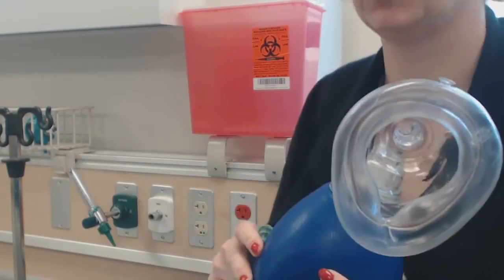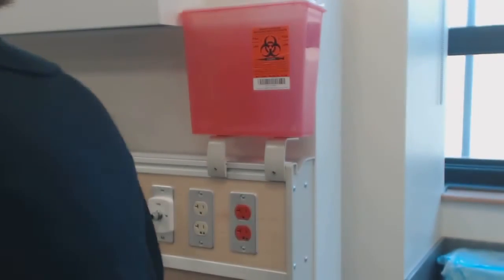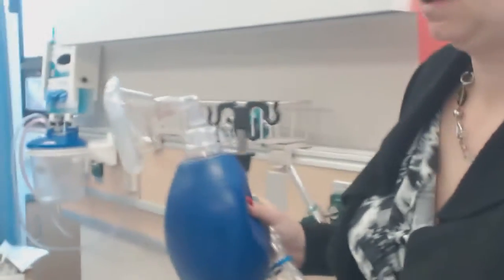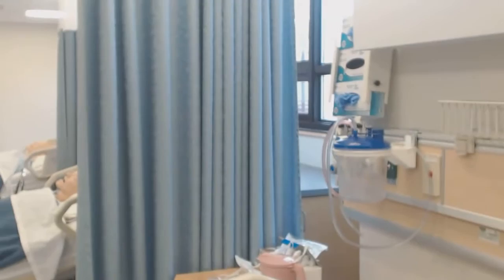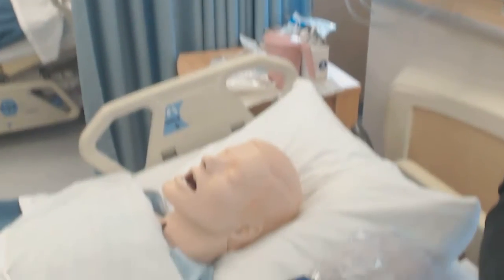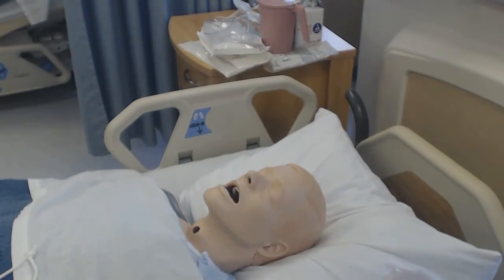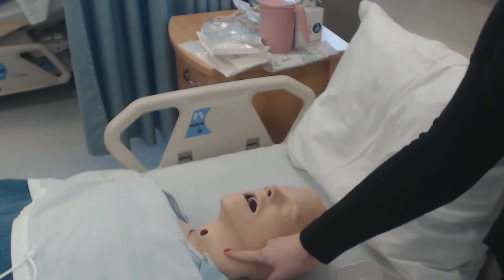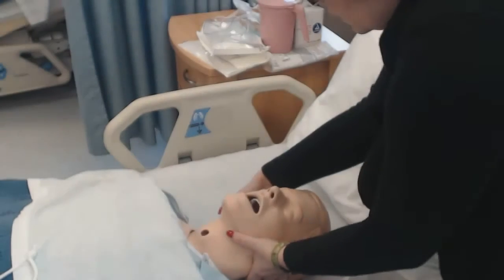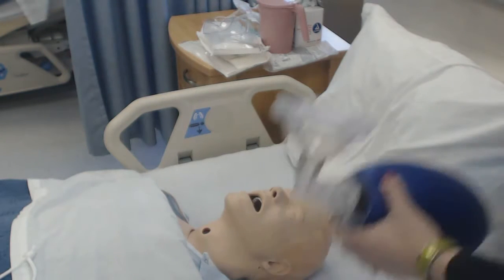Give a little positive pressure. When we put the Ambu bag on the patient, the first thing we're going to do is get the patient in the right position. So with a patient in respiratory distress, I put the patient flat and take the pillow out — look and see that I've opened up the airway. Then I hook up the Yankauer suction and connect the bag to oxygen.